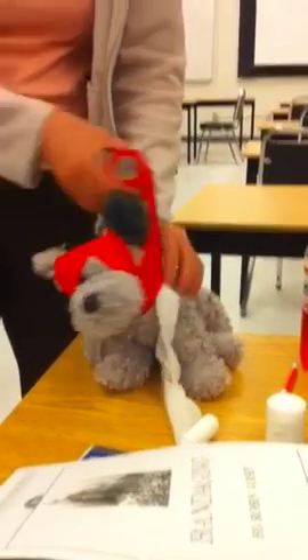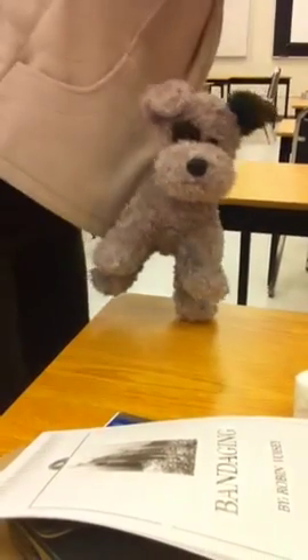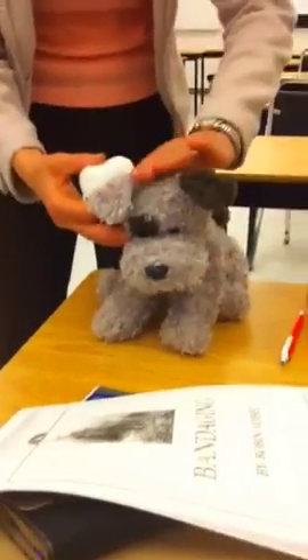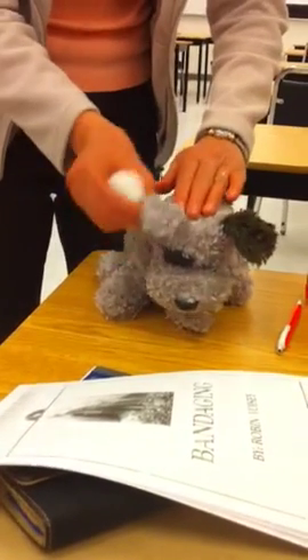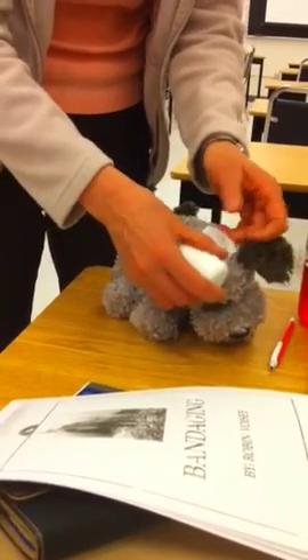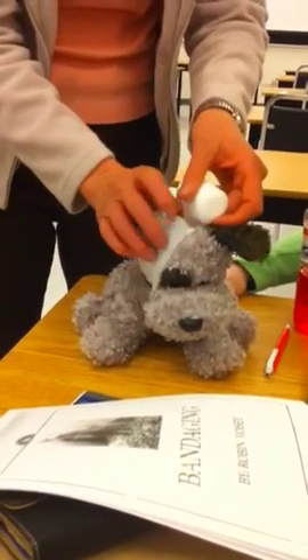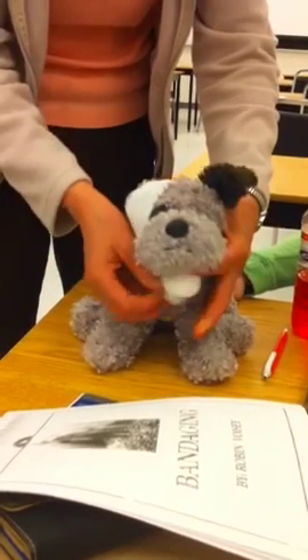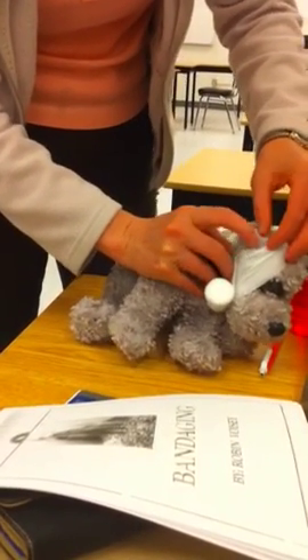The only difference is if you are going to do ear up. You put a piece of gauze here and then fold the ear up so that the gauze protects the ear flap from the bony head — so that acts as padding. Abby stays up better too, this dog keeps falling to the table. So you're going to go same diagonal, under the chin, second diagonal, so that the ear opening is seen.